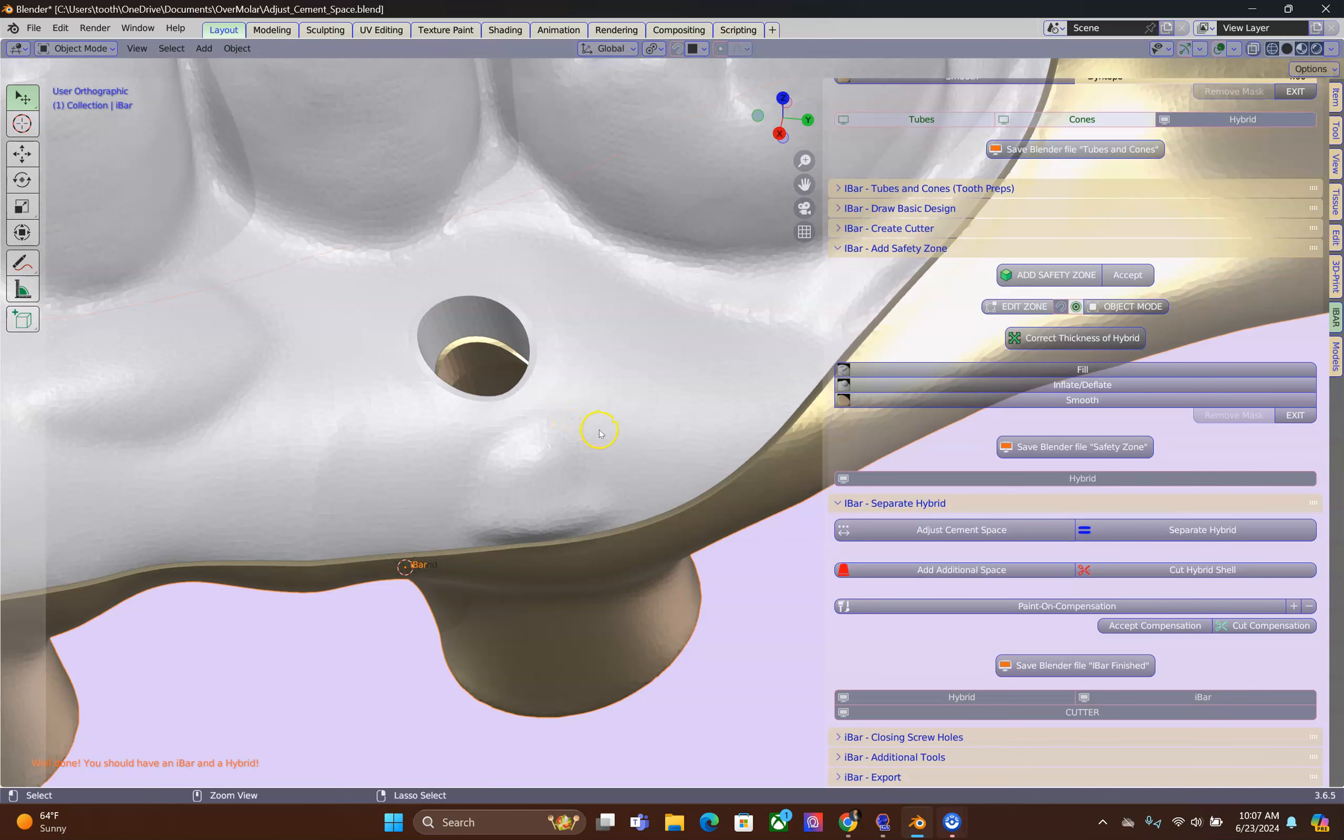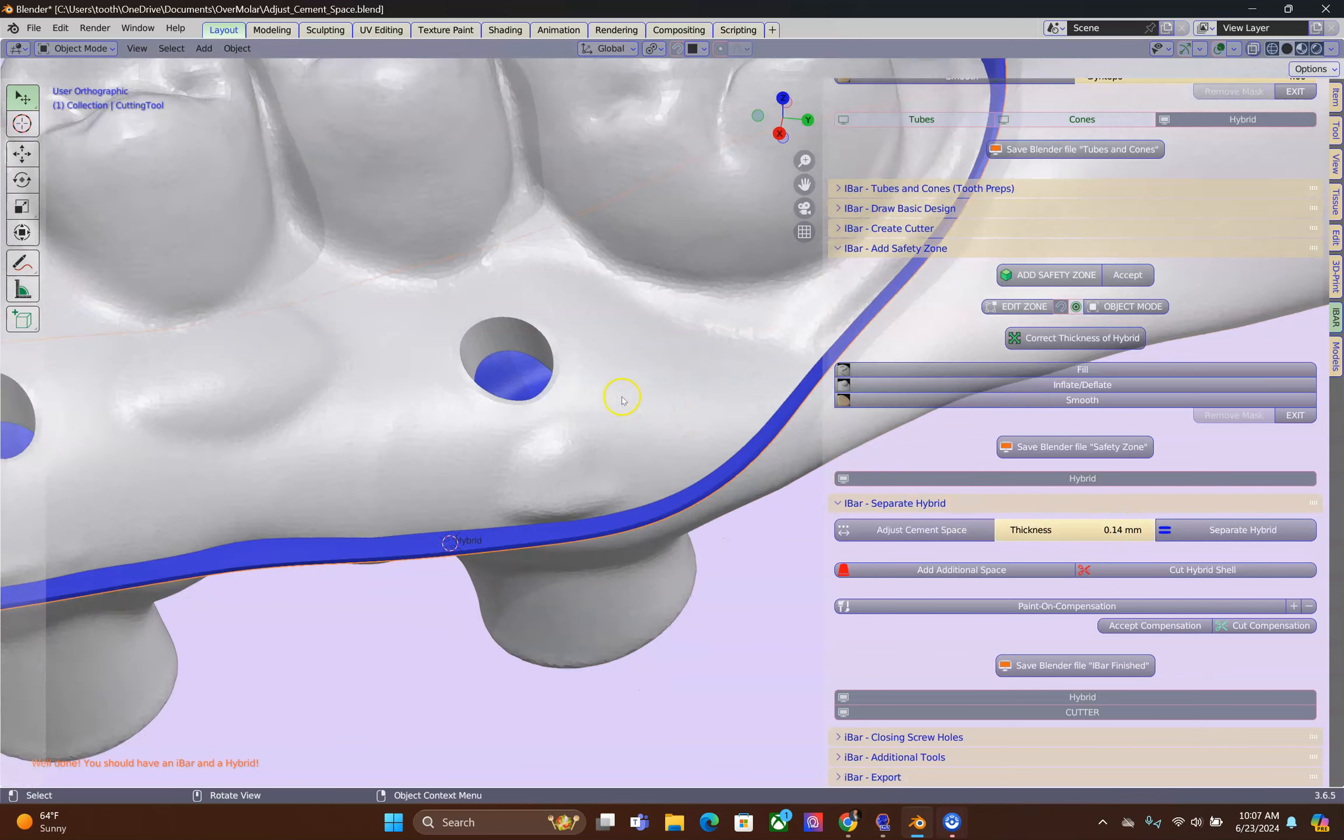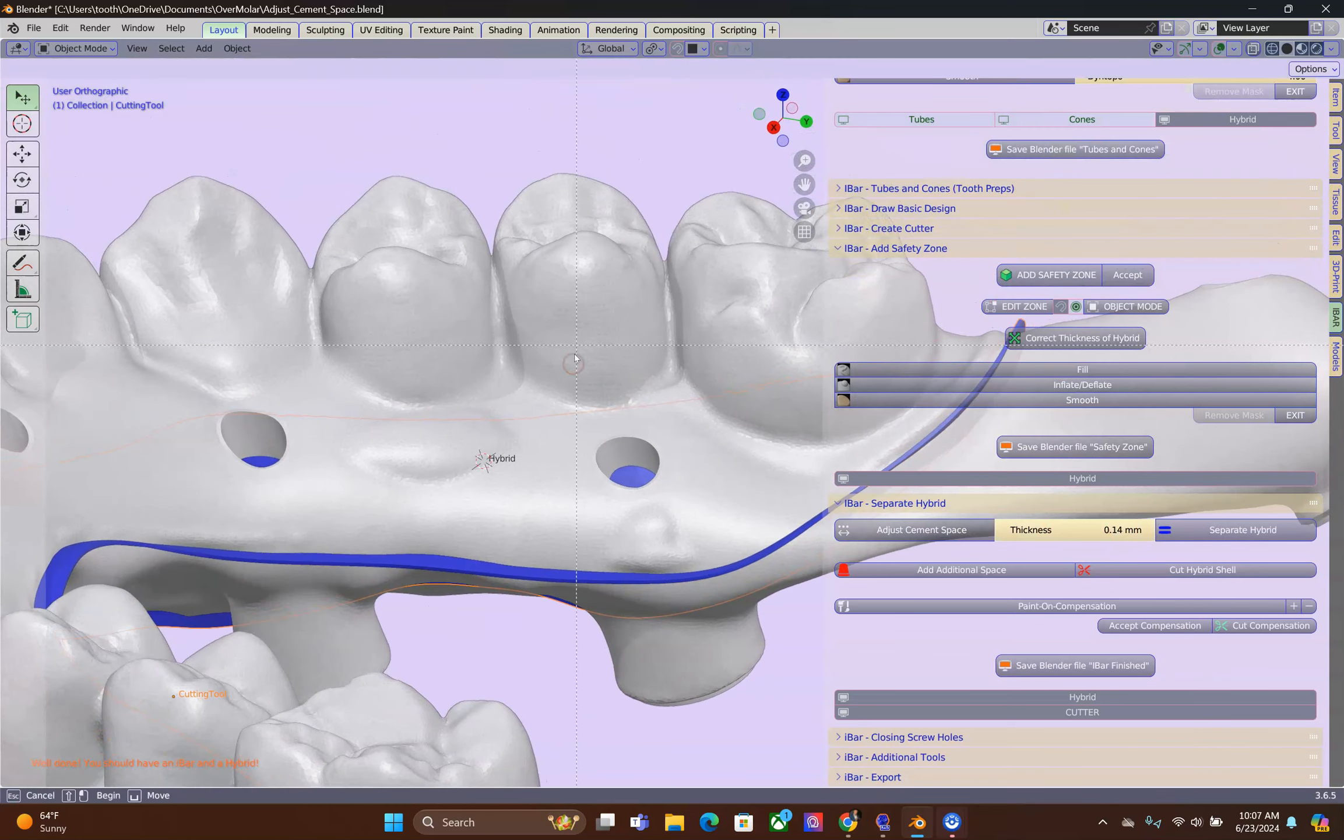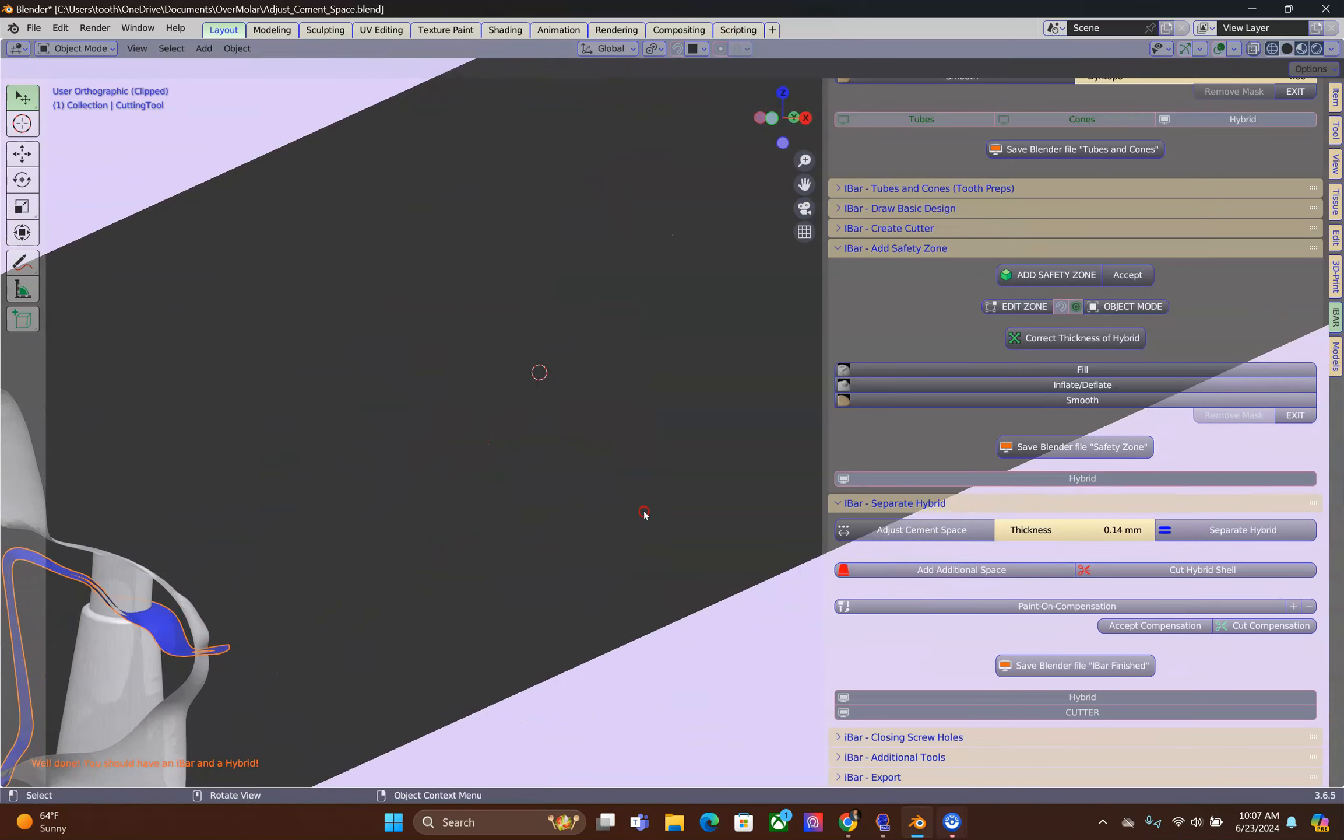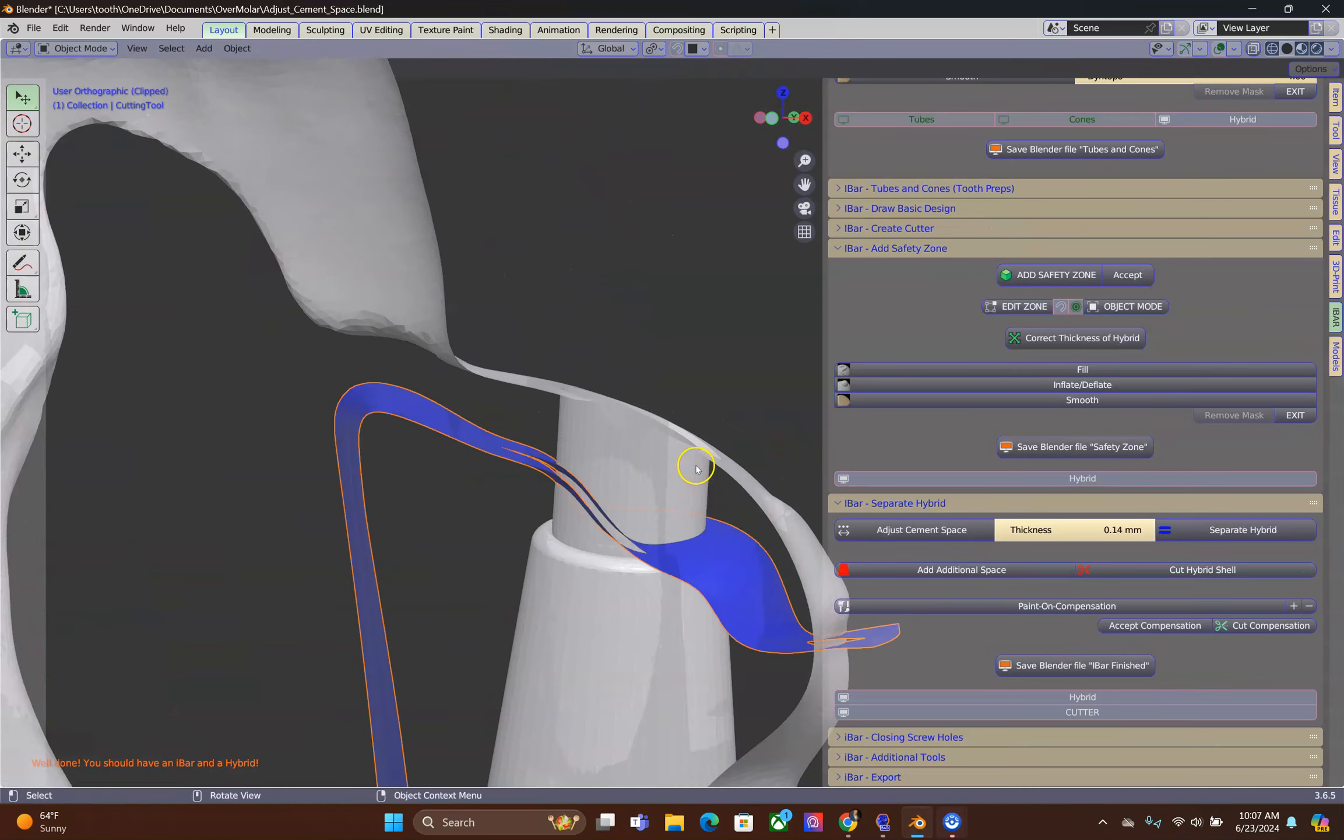Ctrl-Z a few times, slowly, until you get the spacer over here. Using Alt-B, cross section mode, I am going to check to see what the issue is.